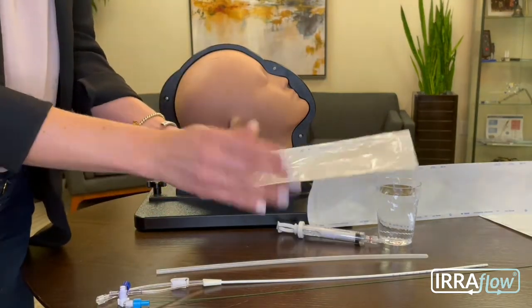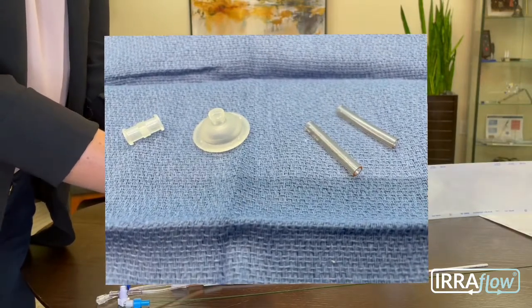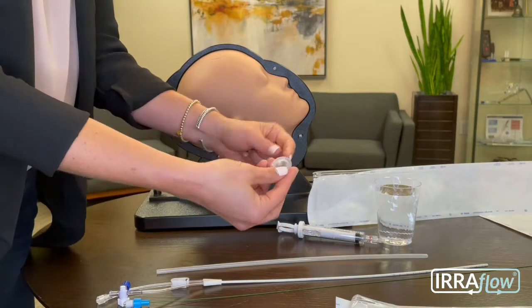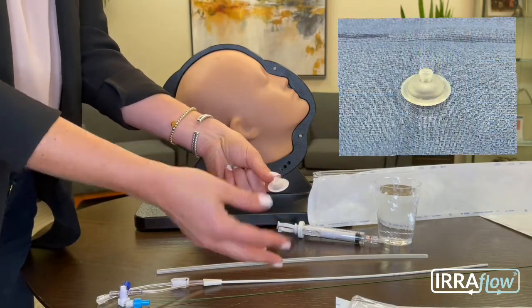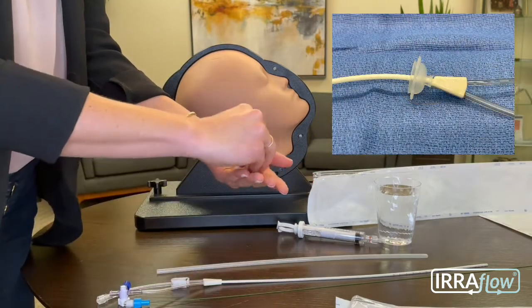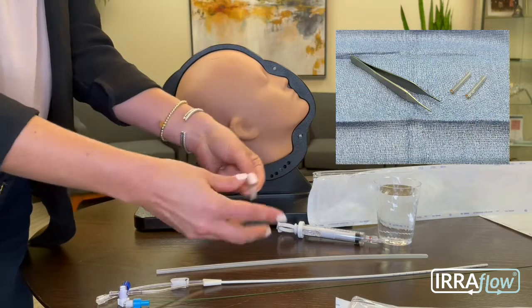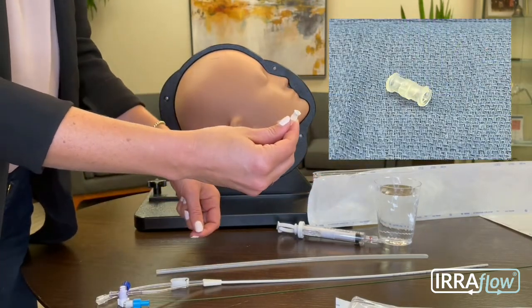When you open the IRRAflow accessory kit, remember that the only component you're probably going to use is the male-to-male connector to flush the catheter. The items included in this pouch are the bacterial dome, which you can fill with bacitracin, protective covers for tweezers or Kellys, and the male-to-male connector.